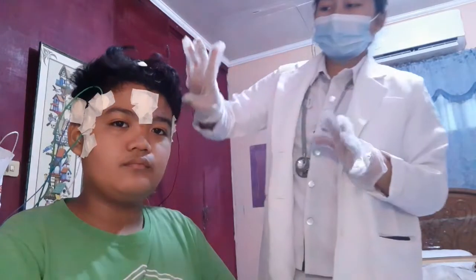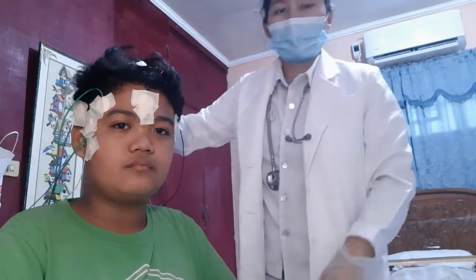After we place all the electrodes with gauze on our patient, we will secure it at the back. Okay, move, sir.